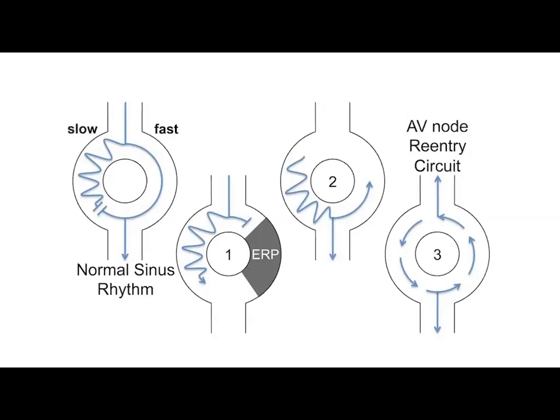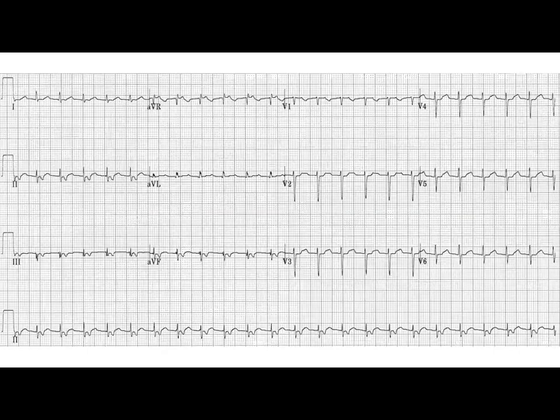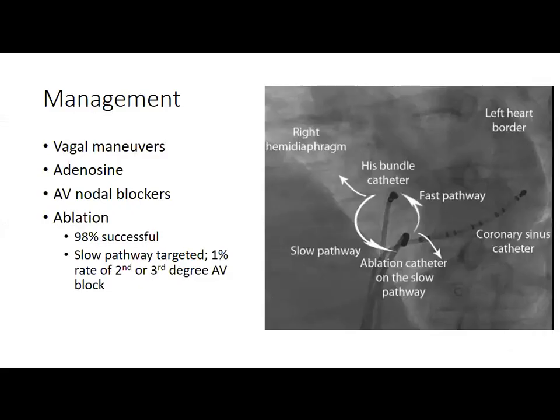Your atrium are contracting after basically this AV nodal activity and slightly after your QRS complex. So that's why you see a QRS complex, and then that electrical activity is getting sent back up the pathway. And this is actually a P wave, a retrograde P wave, signifying atrial contraction. So look out, if you see these, think AV-NRT.